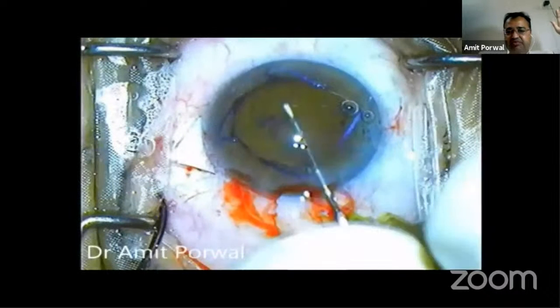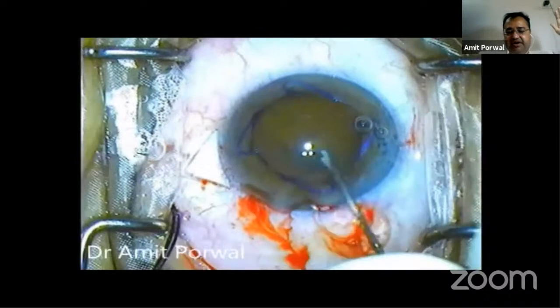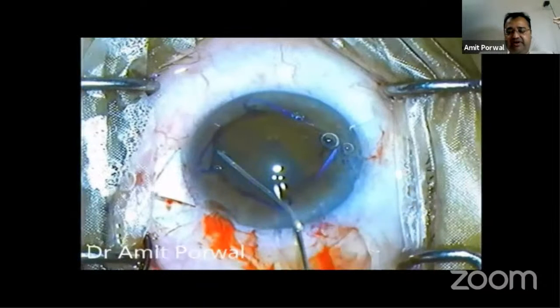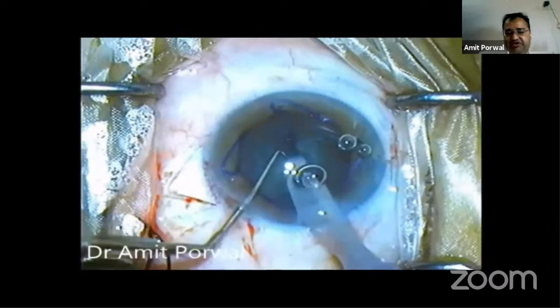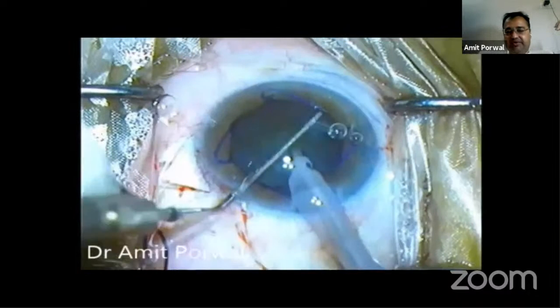These devices lie at the pupillary plane, so that is a great advantage. You don't have any peripheral shallowing of the anterior chamber or anything. Now you proceed with the normal phaco technique. Whichever technique you are well versed in or used to, you could proceed with that technique. After doing the rhexis, I'm well versed with the stop and chop technique. That is the most comfortable technique I'm used to, so I do a stop and chop technique.